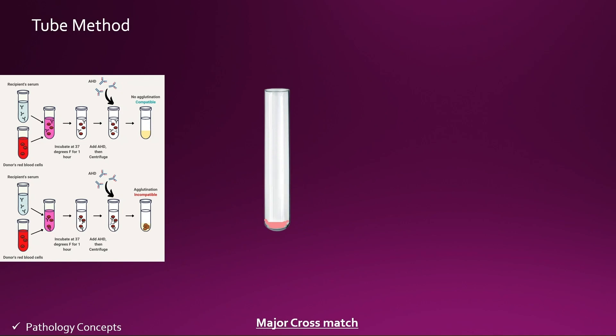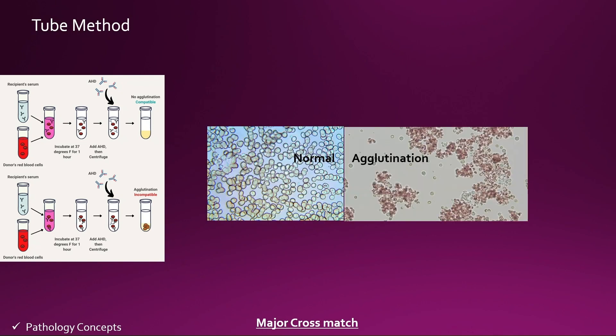Incubate 5 minutes at room temperature, then centrifuge for 1 minute at 1500 RPM. Check for agglutination under the microscope.